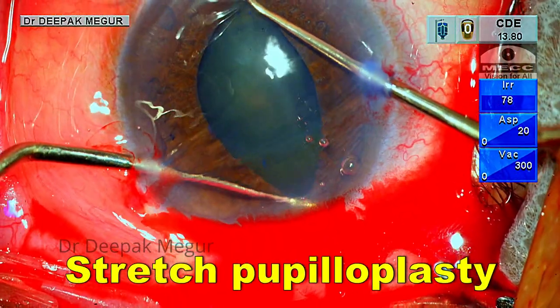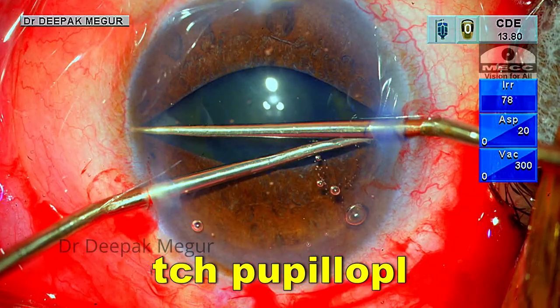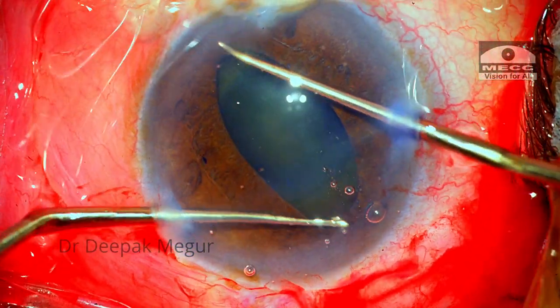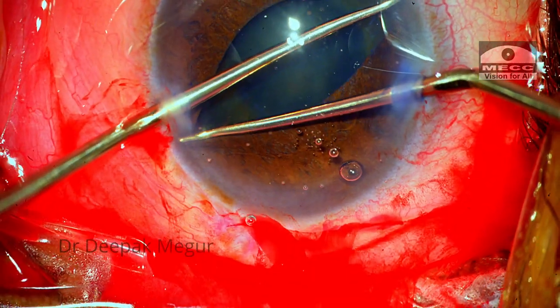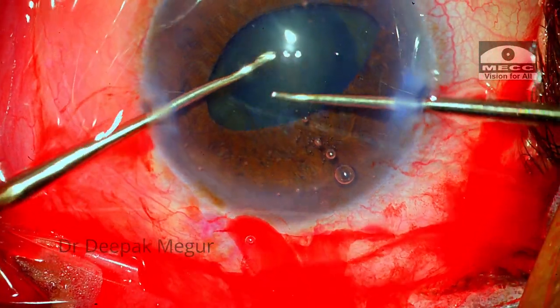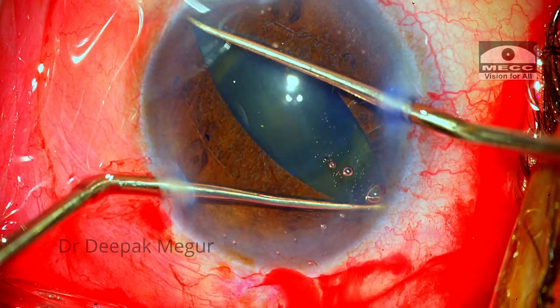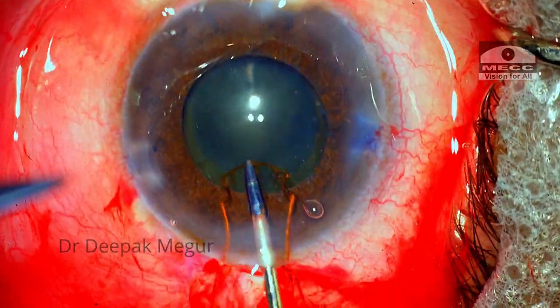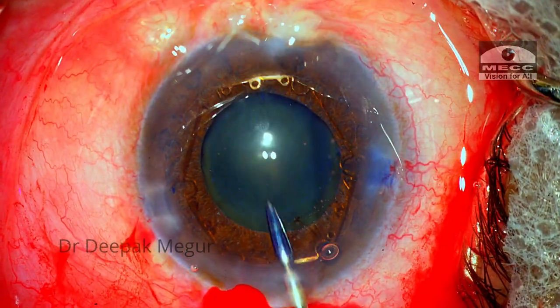I am using Y-hooks to stretch the pupil before inserting the B-hex ring. I usually prefer to do this in four directions. I am careful not to over-stretch the pupil so that the sphincter does not tear. The B-hex ring is then placed over the surface of the iris.